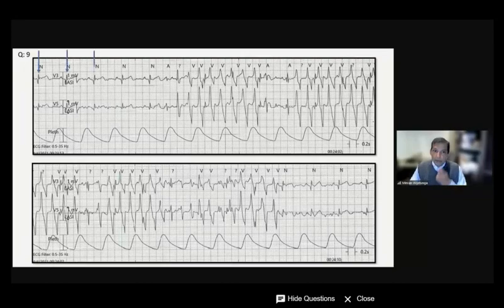And how do you know that? So first of all, you find QRS complexes, and you can see some, the baseline is not so straight. Now that's a clue, but at least what you try to do is find things that you can locate. So first of all, in this one, I saw QRS complexes. And then the other thing is these QRSs here, they look bizarre. They don't look kind of normal. Now that's a gut feeling.